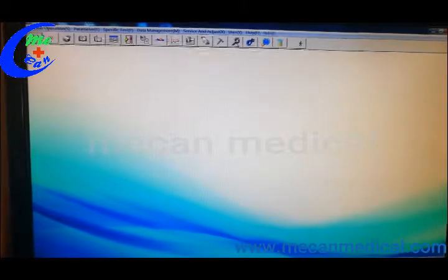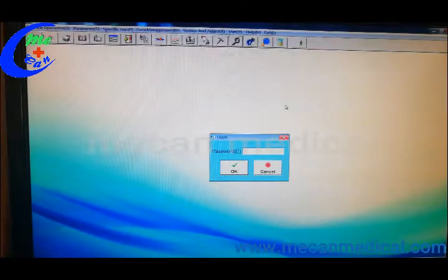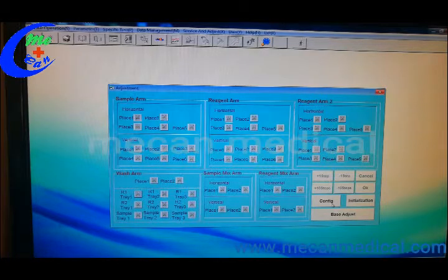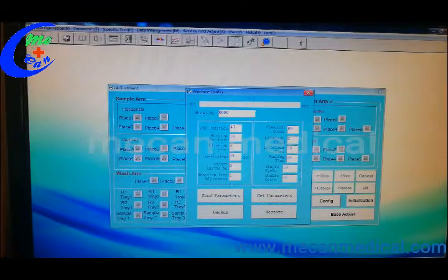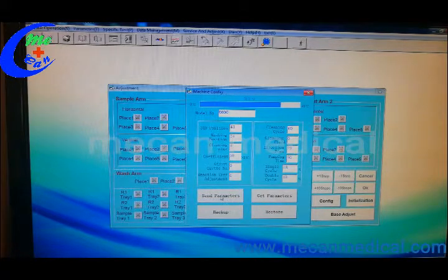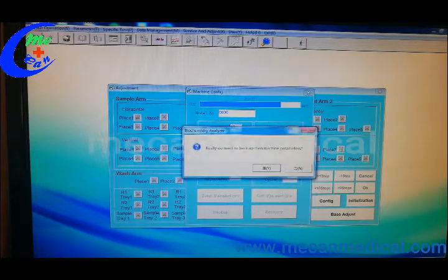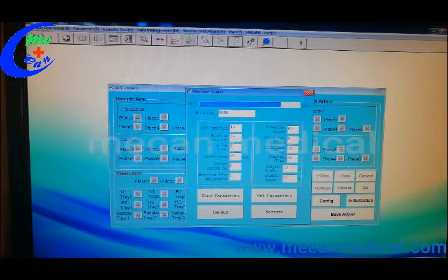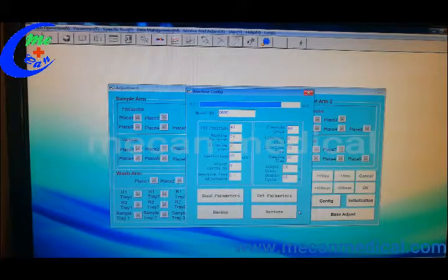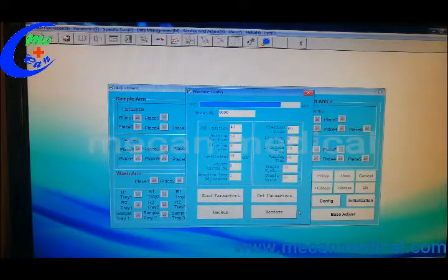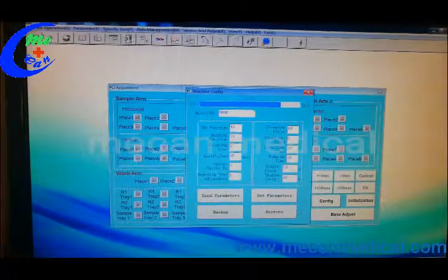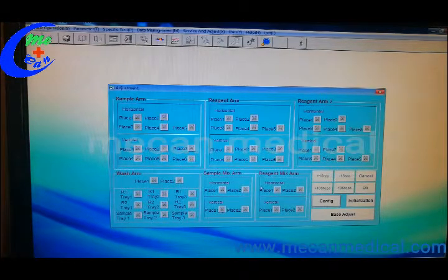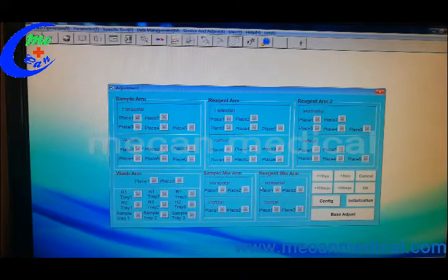Firstly, you should go inside the adjustment password 6 times 6: 1, 2, 3, 4, 5, 6. And you should get config from machine, send, get parameter, send parameter, and backup. This one will use if you connect with new machine, then you can restore the database from this software to the machine. And then you should adjust this part according to our user manual.